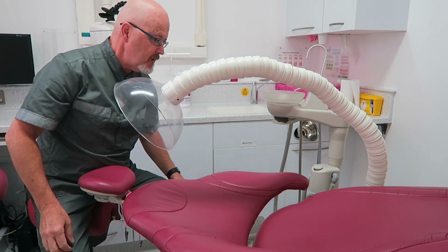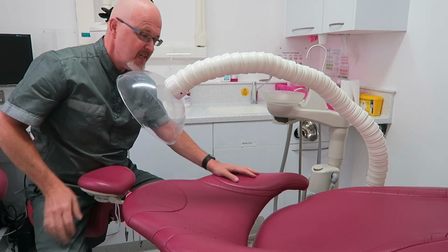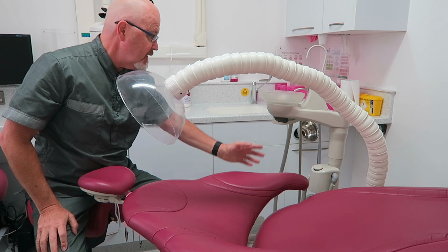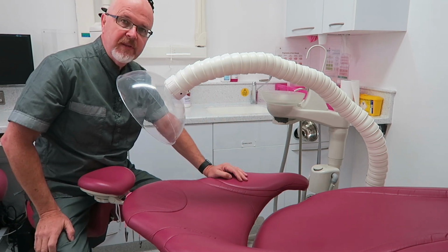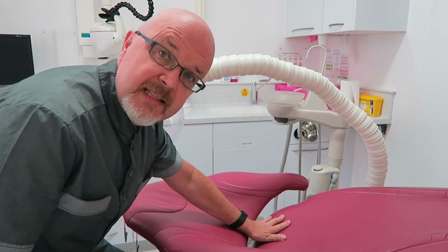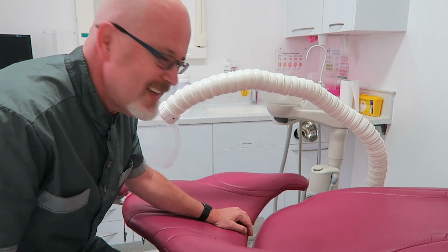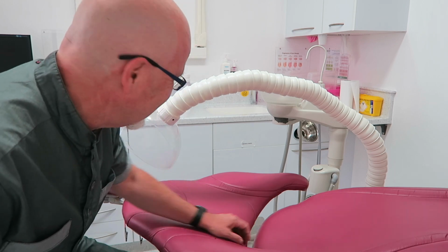But of course, if you've got a limited walkway where you need the base of this unit to be relatively close to the headrest, apart from this creaky noise, then it can have limitations, and I think this is the major problem with this unit. Okay, so we'll be moving on to the next room now, and we'll be placing this into a different environment.